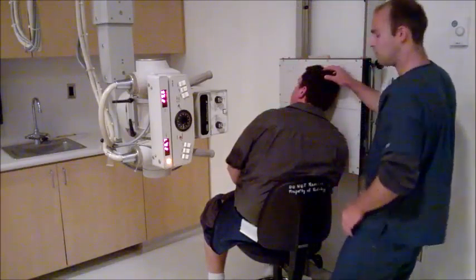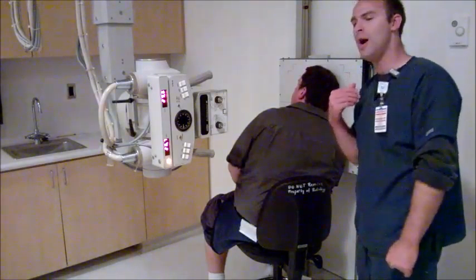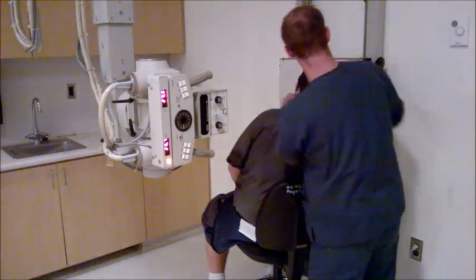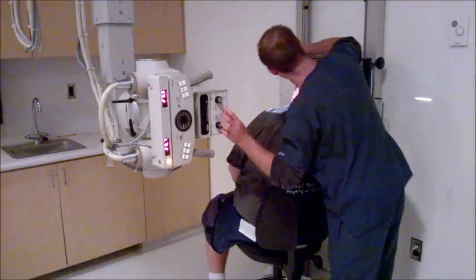Now what we need to do is have his head tilted 30 degrees towards the board because we're going to do a right side mandibular body radiograph like that. And then get my marker. It's the right side. Put it on.